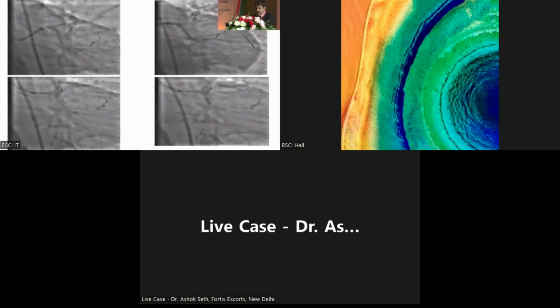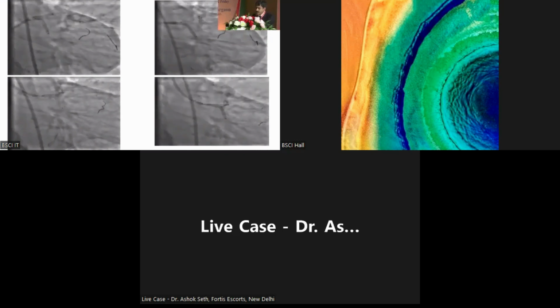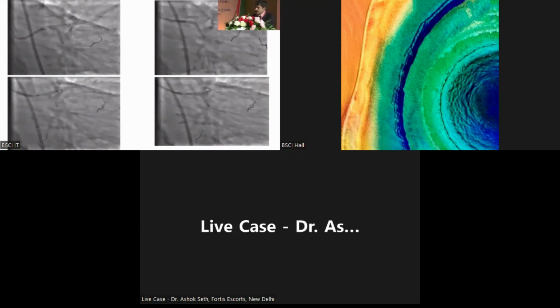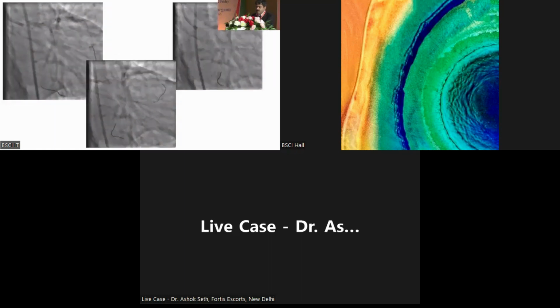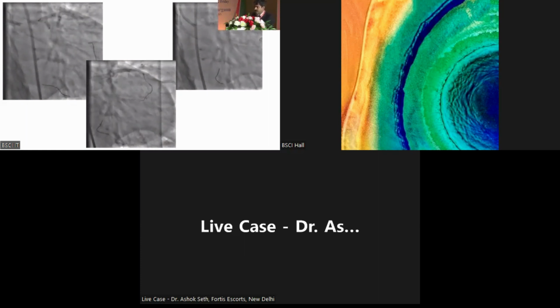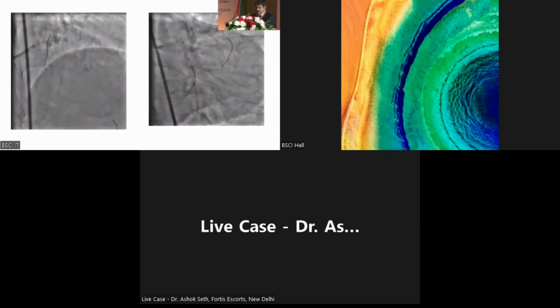Then after inflation of your stent, we flared the stent with the stent balloon after pulling a few millimeters, then crushing with the main vessel balloon, and then first kissing. So this is the stepwise description of the nano crush, and then put the stent in the main vessel from the left main to LAD, then recrossing, wiring, final kissing, and final POT. So this is in a nutshell the nano crush technique which we are practicing in our hospital, and gradually the evidence with the nano crush is increasing, and side branch wiring and long-term results are very satisfactory with this technique. So this is the final result.